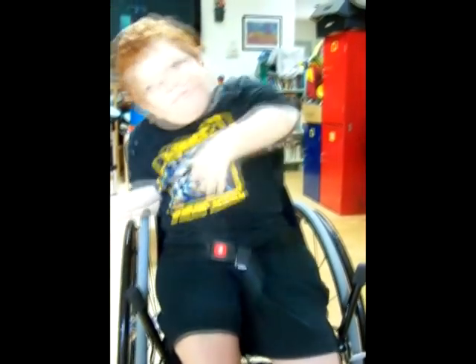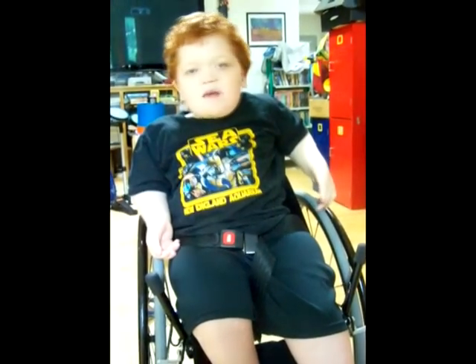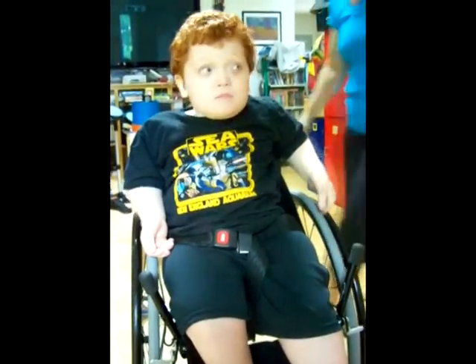This is Conan in his new wheelchair without his brace on, and he's going to show you how he's able to get around in the chair. Conan, can you reposition yourself so your bottom's back? No. So you need Mom to help you pull your bottom back? Mm-hmm.